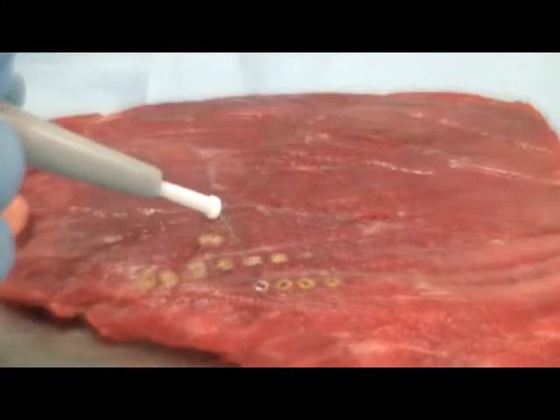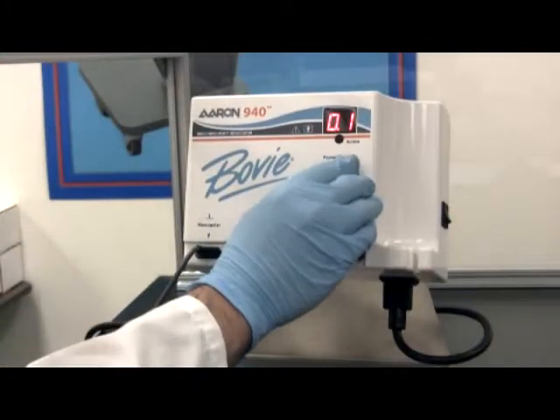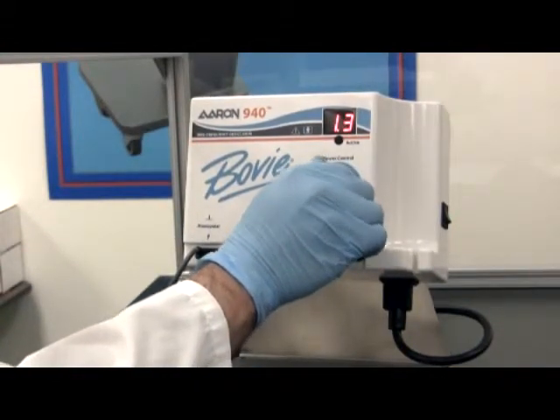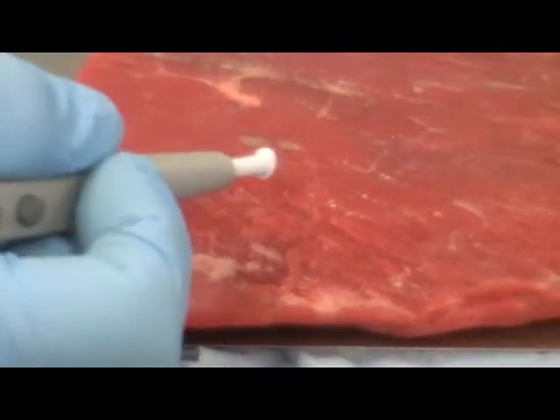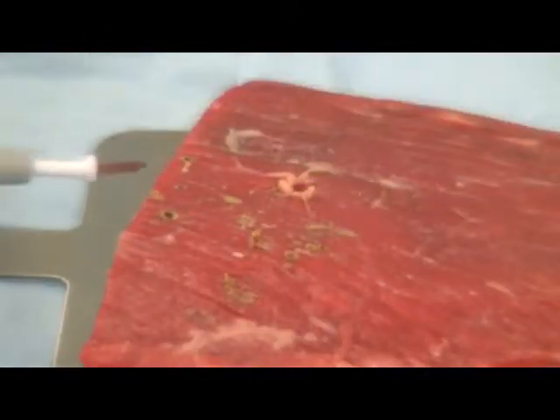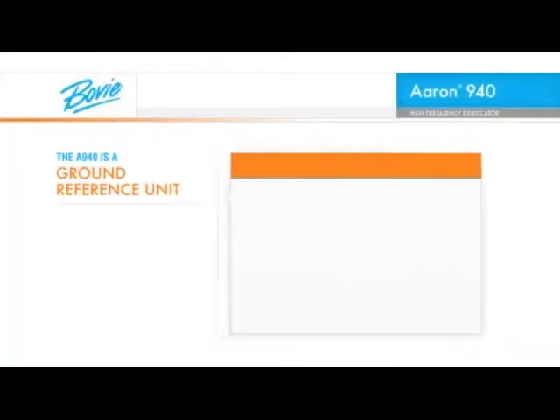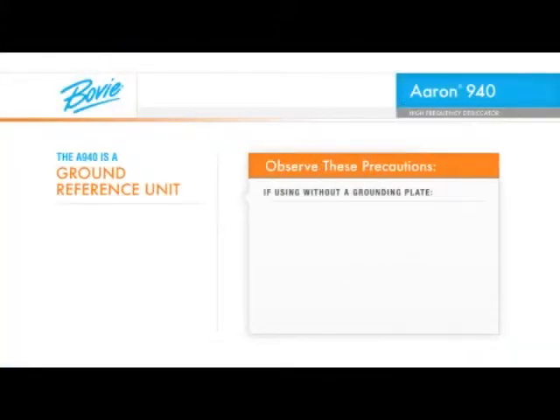You need to avoid applying too much power to the tip. Be sure to adjust the power conservatively at first. As you use the A940 desiccator for a particular procedure, you will become accustomed to the settings you need to use. The A940 is a ground reference unit, meaning that you can use it without a grounding plate. However, there are some precautions you must observe when doing so.